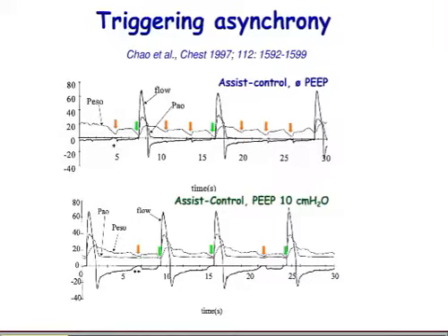This means that if you are ventilating a patient at risk for intrinsic PEEP, most of the time patients with COPD, and you witness ineffective efforts, you should look at whether increasing or applying external PEEP might offset this inspiratory threshold load of intrinsic PEEP and thereby decrease the number of ineffective breaths. This is not the sole action to take in the face of ineffective efforts, but this is at least one that should be taken into account if ventilating a severely obstructive patient.